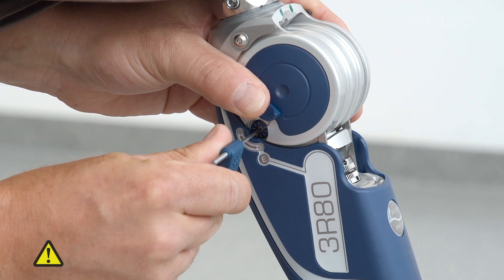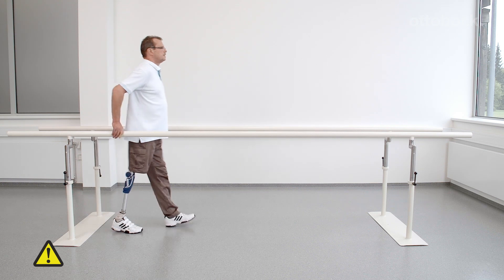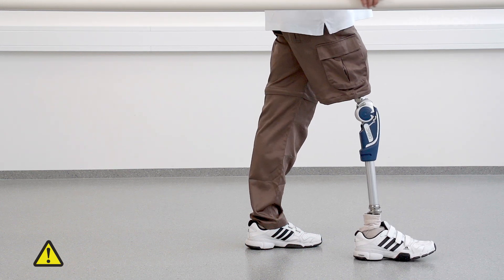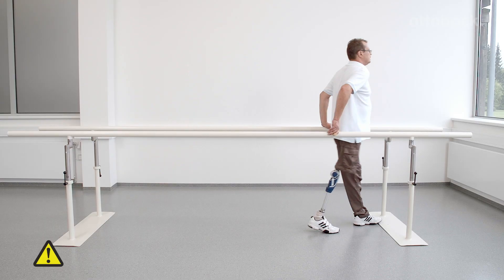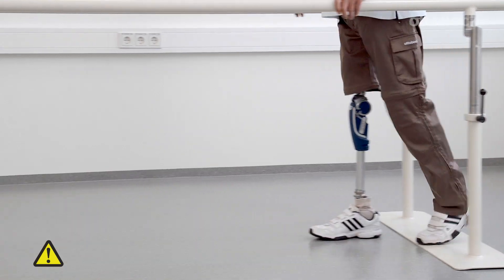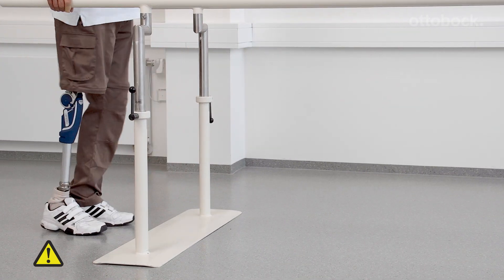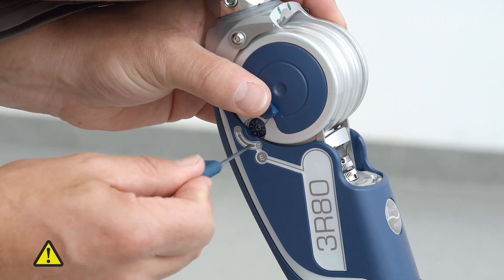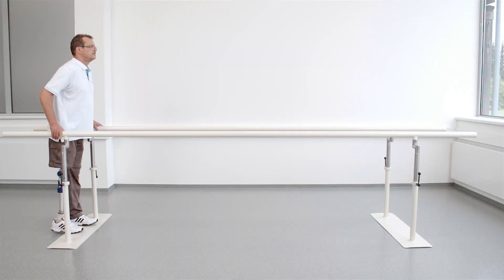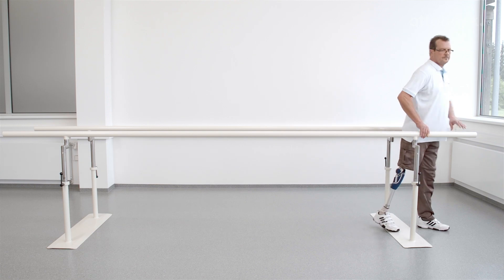It is important to always take small steps when adjusting away from the factory setting of minimum extension damping. As shown here, an extension damping set too high means that the knee joint no longer comes into full extension, which could lead to a fall. Reducing the extension damping setting ensures that the leg will reach full extension at heel strike. The extension stop can be adjusted individually to the user's needs.